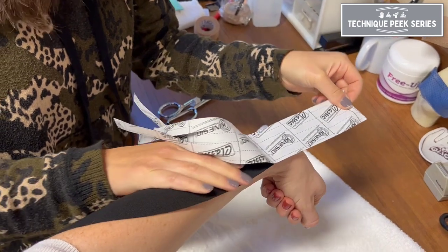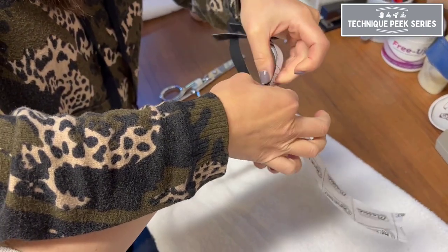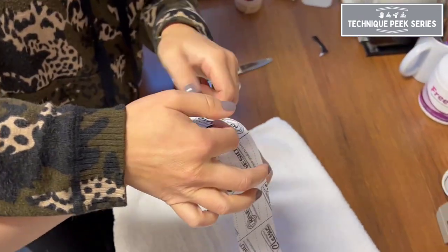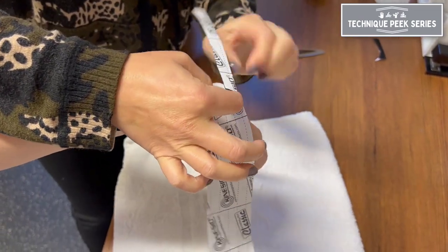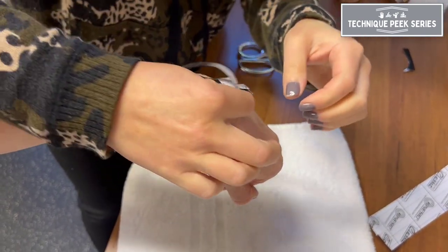Apply the remainder of the tape with 15 to 35 percent tension. To make application of the finger portion easier, tear the tape backing from each tail and then remove the center strip.